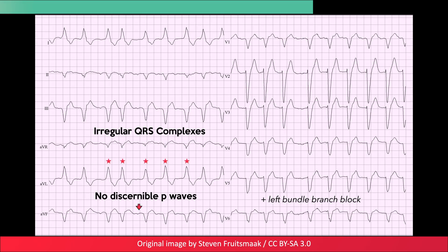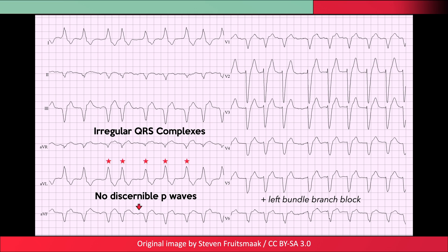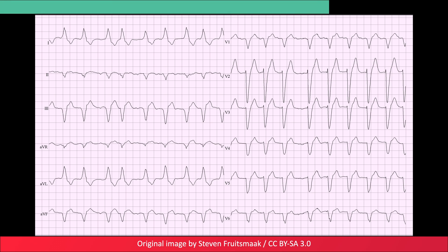On first glance, an ECG like this can be somewhat perplexing. There aren't any P waves, and the QRS complexes are wide. This isn't ventricular tachycardia, but atrial fibrillation with aberrancy. More specifically, this patient has a wide QRS complex due to left bundle branch block.